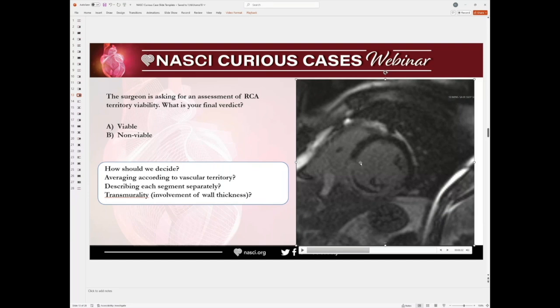Any other contribution before we move on? Yes. I just want to ask about the same thing that Dr. Mahmoud asked about. To the best of my knowledge, MVO occurs in the acute ischemic state, acute infarct, and I think we judge if the myocardium is viable or not after 28 days. It's just for my knowledge. Can we judge viability in the acute state?